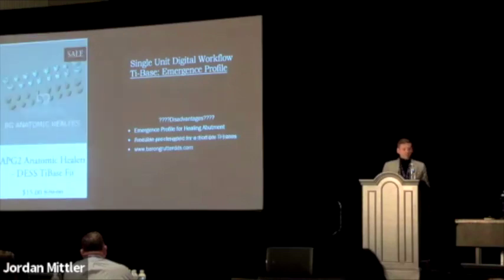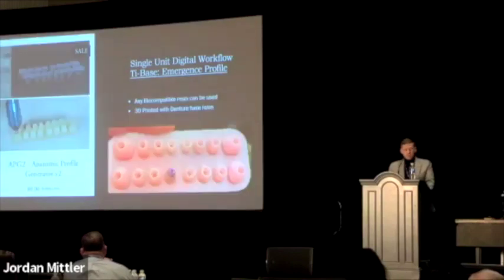So for people that don't want to play around with the software as much, they do sell pre-designed ones for a nominal fee. I think they have 2 or 3 different options. Okay. And since we're printing this, it can be any biocompatible resin. So you can 3D print these healing abutments in a denture-based resin to have a pink shade to it. And patients kind of appreciate that. Not that it really matters, but sometimes they wonder, oh, what's this metal thing sticking out of my gums? So that's just another option.